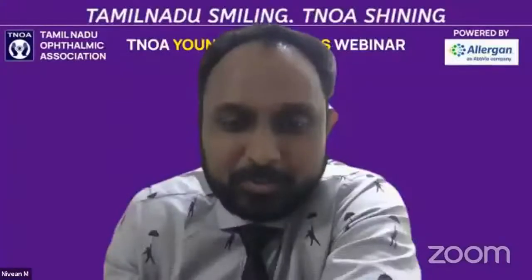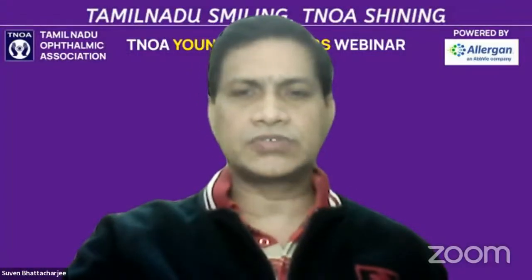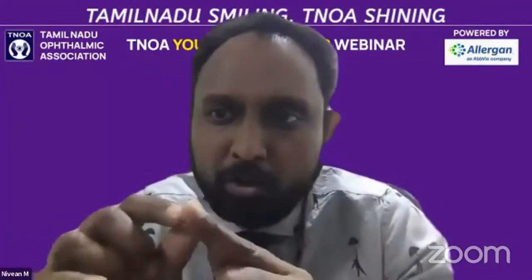So that's a good idea, Nivean. Taking a tunnel, rather than a flap. Instead of a flap, you take a tunnel and just pull into the tunnel. Nicely, it looks very nice. Yes, sir. Simpler also. Nivean, one question: what forceps are you using? You're using a VR forceps for that? It's a vitreoretinal forceps. I've actually designed 2 forceps, sir. So one thing is to grab the haptic, where only the tip alone is broad.